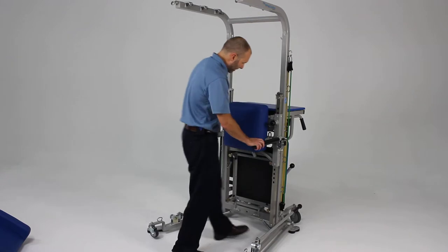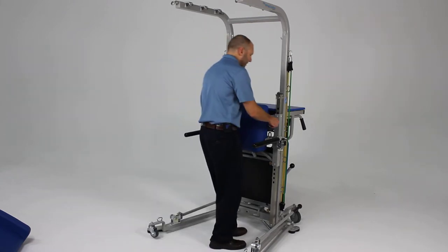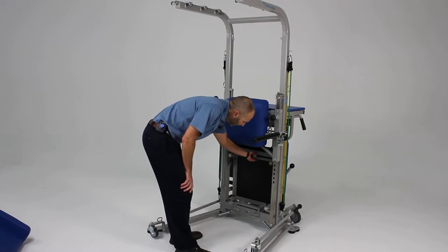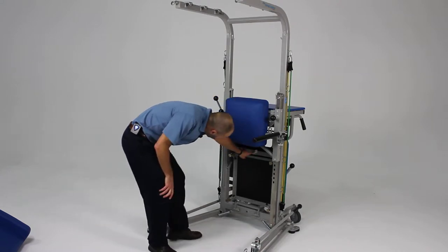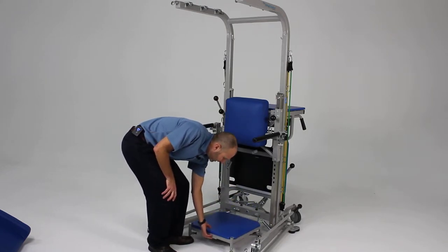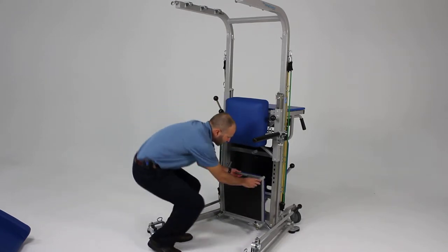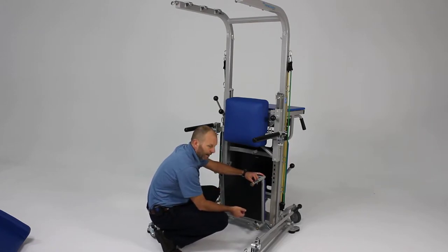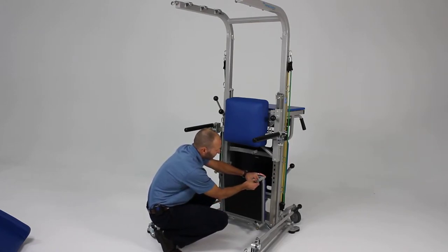We can raise this up higher and then pull out a stair that has a little plastic release lever and can be lowered into place. This step is also adjustable in height from four to eight inches in two-inch increments.